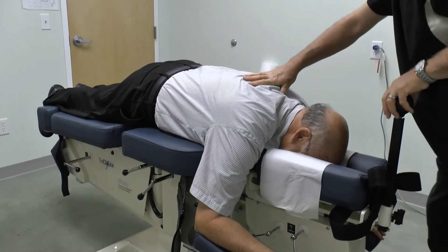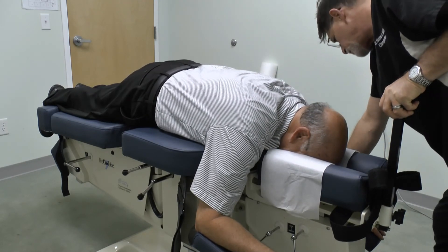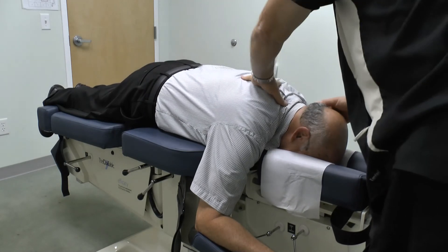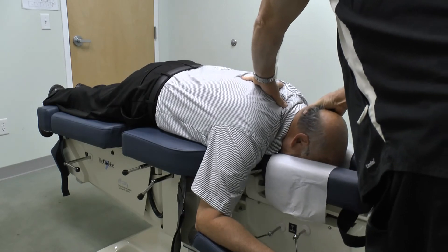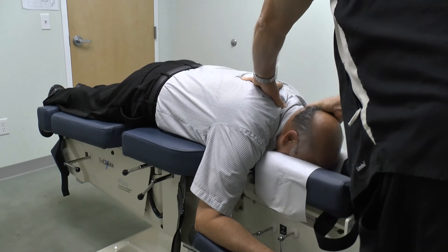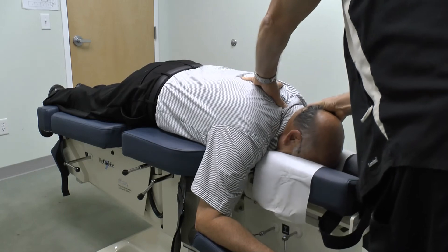And we'll finish this with a combination of lateral flexion, long y-axis, and rotation. Still doing okay? Yeah, doing good.